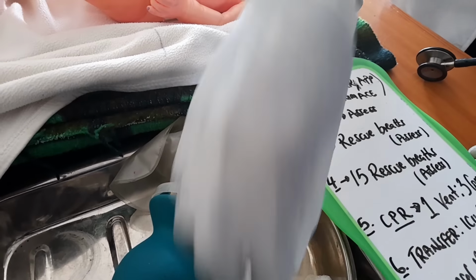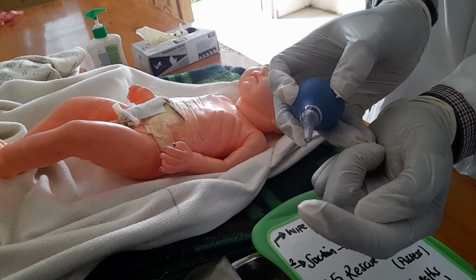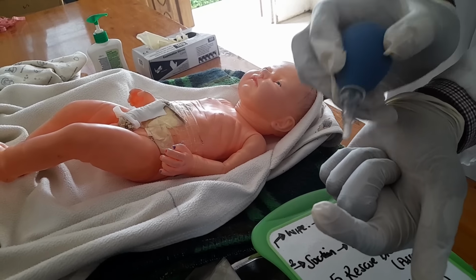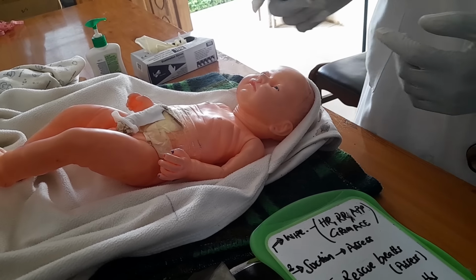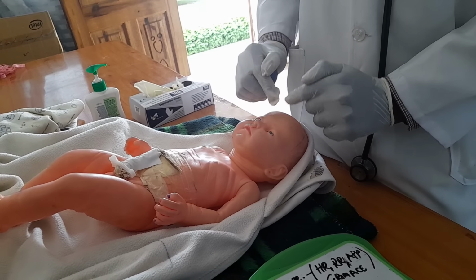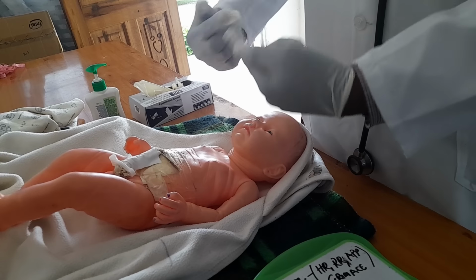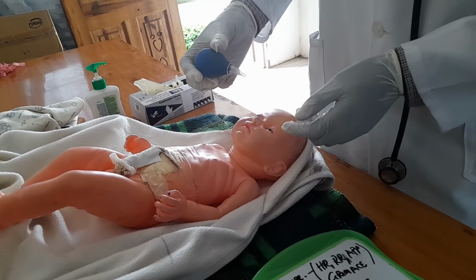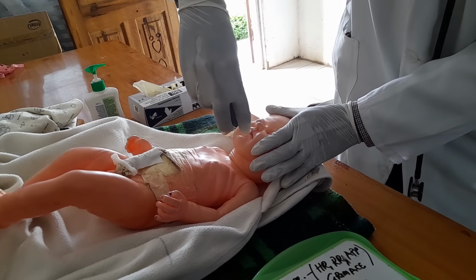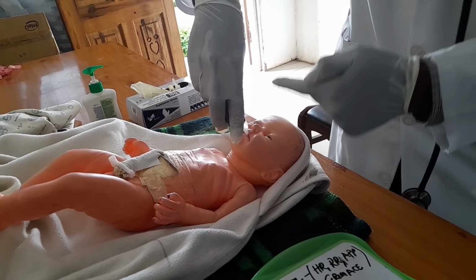So on suctioning, what you do is you get the penguin sucker. So this is a penguin sucker. Then there are even longer ones. This is very short, but you get maybe those longer ones so that they reach up to the intended site for suctioning. So there are 2 sites here for suctioning. We've got the nostrils, we've got the mouth. Here it also matters where you start from. Should you start from the nostrils or should you start from the mouth, which is a bigger cavity? So you start with the mouth. You push the penguin sucker in the mouth until it goes deep, up to a point where it can suck meconium. If there's meconium, it should be able to suck the meconium out.